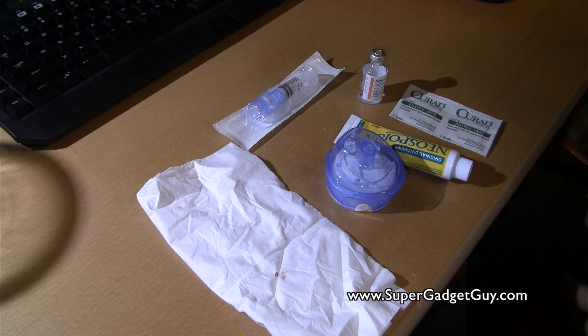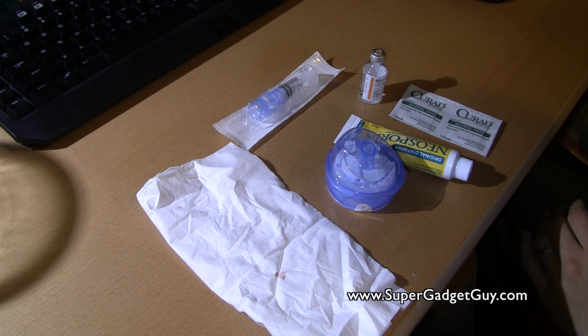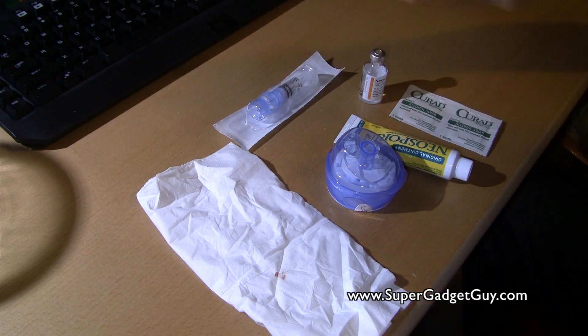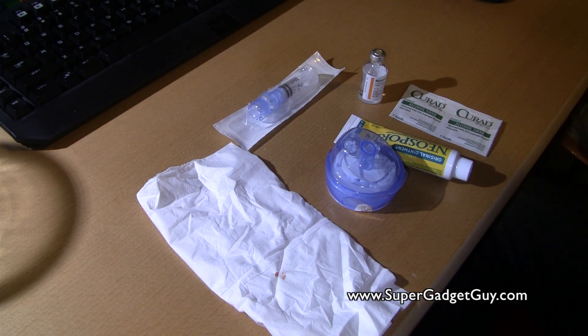Just a bit of warning: you will see needles. You might or might not see blood, depending on how my last infusion set insertion went. Right now they are in packaging, so even with high definition you won't see them. Warning — there will be needles, and there might or might not be blood.